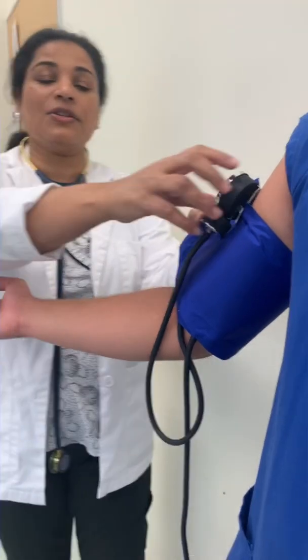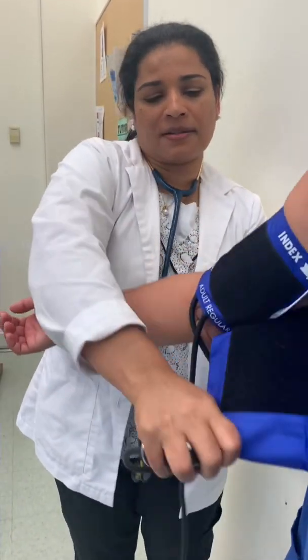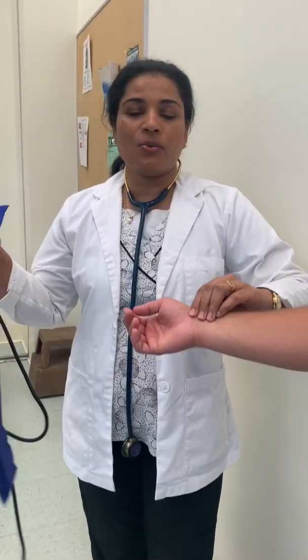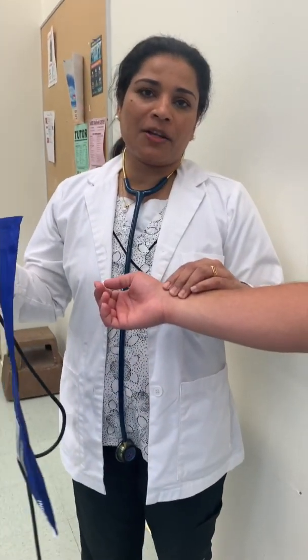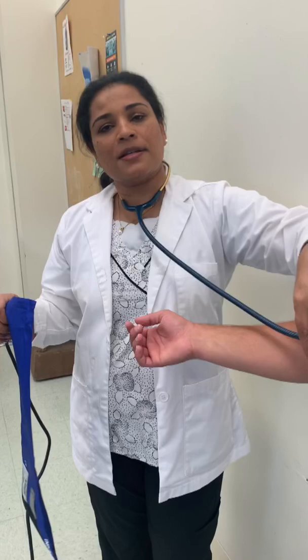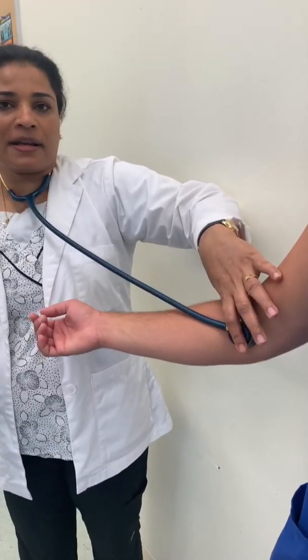So that is the two-step method. In the first step, you check the cuff at the radial side, inflate the cuff, and get an estimated systolic blood pressure. Then you add 30 to that and reinflate. In the second step, you use your stethoscope to listen. The first louder sound you hear is your systolic, and the point where the sound fades is your diastolic pressure.